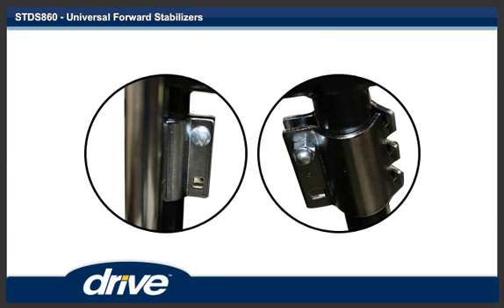Step 5. Insert one carriage bolt through the main body of the front anti-tipper and then the hinge clamp bracket. Put the cap nut on and hand tighten. Repeat this procedure for the other carriage bolt and cap nut.